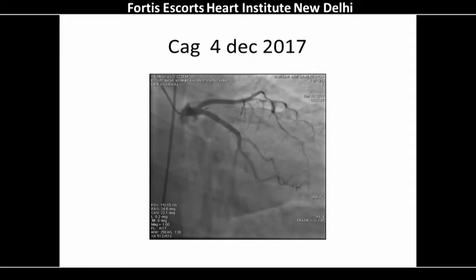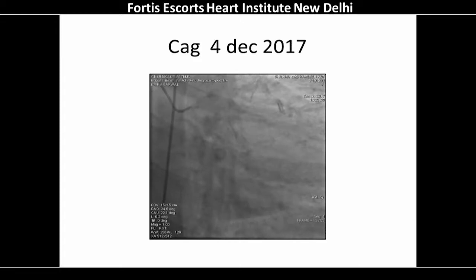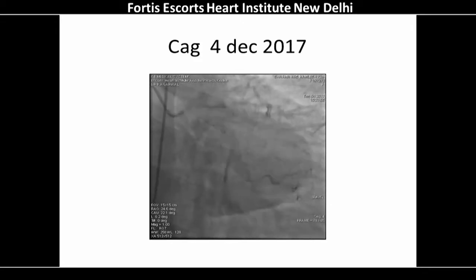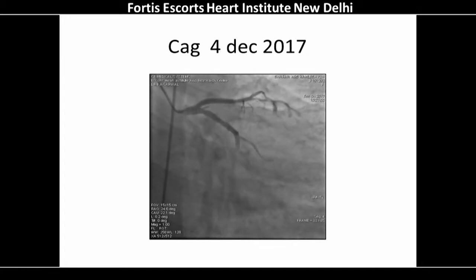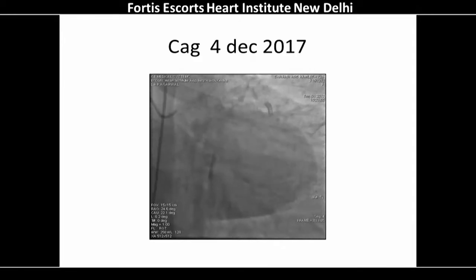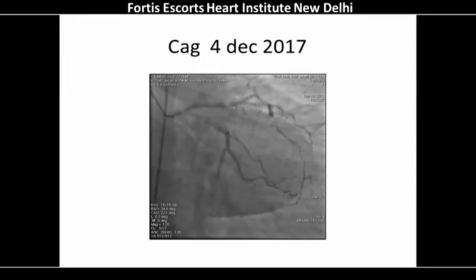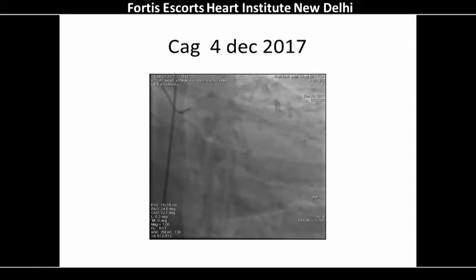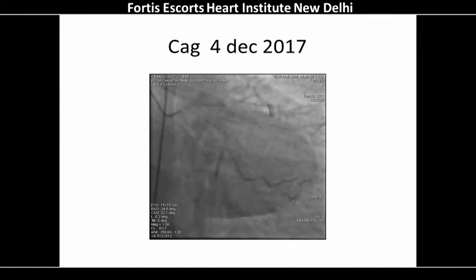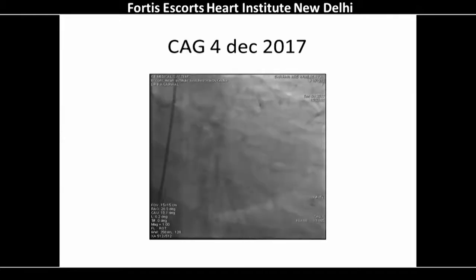This obviously the stent is completely occluded. And if you notice, the stented portion is fine, the occlusion is beyond that. So you have abrupt occlusion beyond the stent, which is most likely some sort of a dissection that was not detected at the time of treatment. This is most likely due to the watermelon seeding of a previous balloon when we were dilating, which was going up and down.